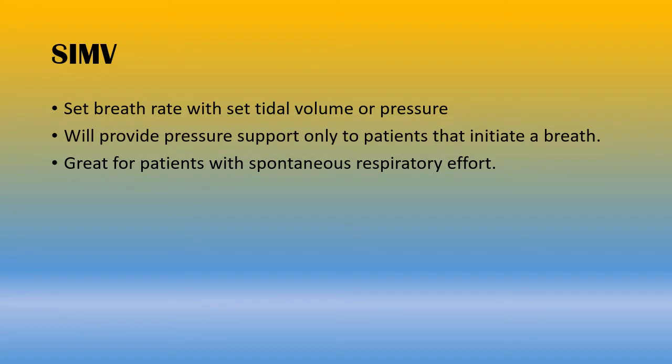SIMV, or synchronized intermittent mandatory ventilation, is a little bit better mode of ventilation because it allows for patient input. There are set breaths at a set tidal volume, but it provides some pressure support if the patient inhales, only to overcome the dead space. So if I'm the patient and I'm sedated, but I still have a little bit of spontaneous respiratory effort, the ventilator is going to give me 14 breaths a minute at 400 milliliters. But if I initiate a breath, it's just going to give me a little bit of pressure support to overcome the dead space in the tube and stuff, and then I'll be able to pull whatever tidal volume that I want to pull for my comfort if I'm the patient.